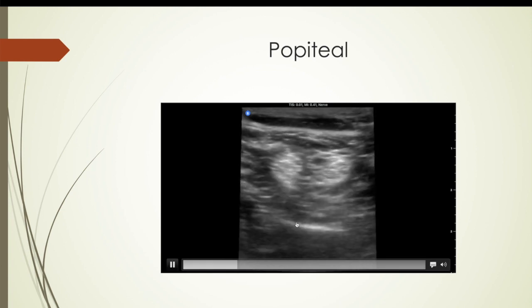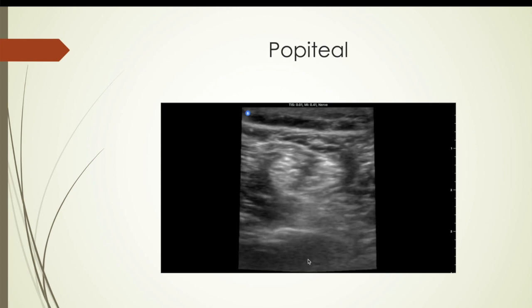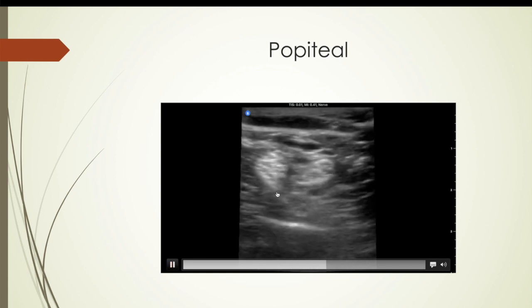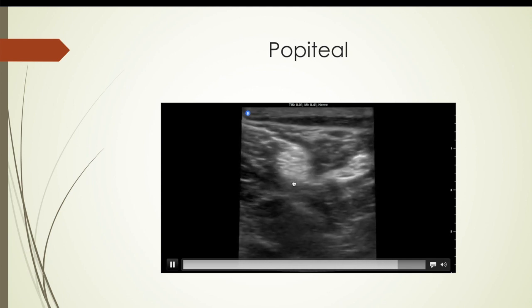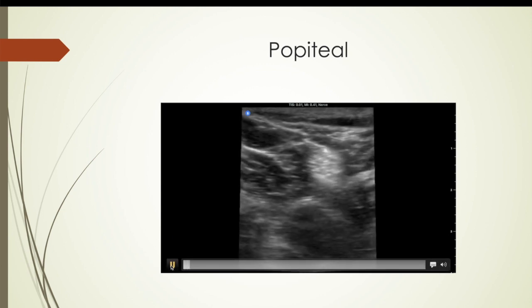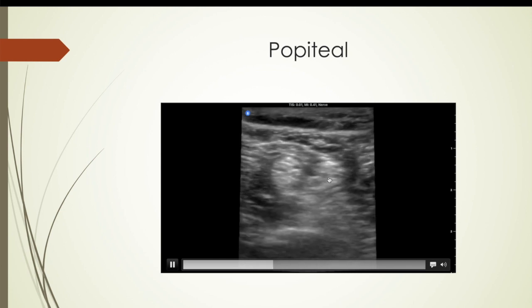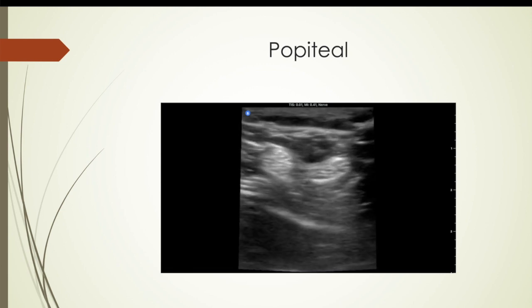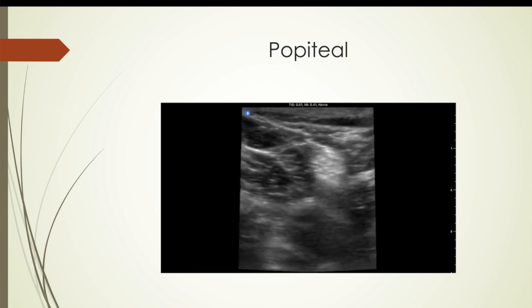Here's a popliteal block — again without the actual block, just the anatomy. You can see the nerves coming together — the common fibular and tibial nerves — and then moving more distally you can see them separating again. The picture is beautiful. If you can't hit that block, something's wrong with you. I use this a lot in the OR, but also in the ER for ankle fractures, foot fractures, etc. — a great thing to do for your patients.